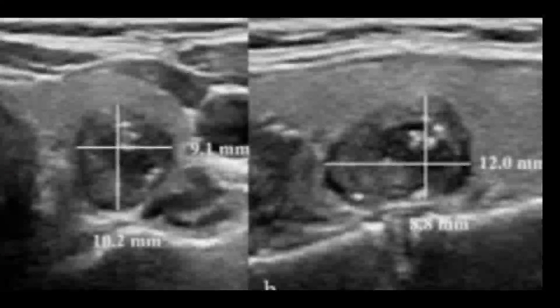So whenever you come across any taller nodule, it would be considered malignant. Look at these images, where you can appreciate two glands in different views. Its anterior posterior length is increased compared to mediolateral. So this is a classical example of a U5 malignant nodule.